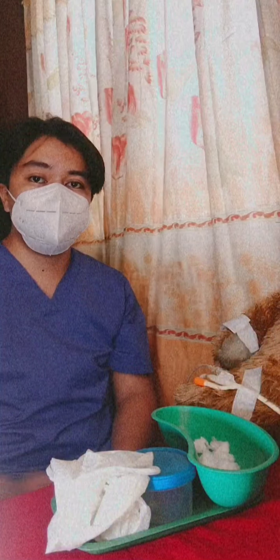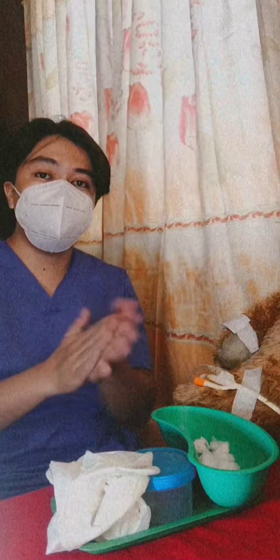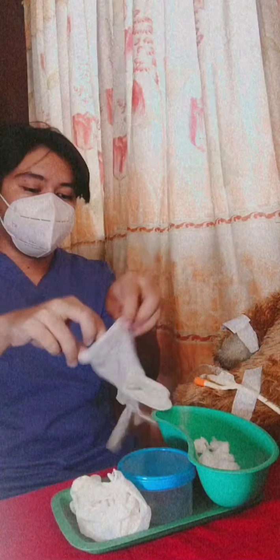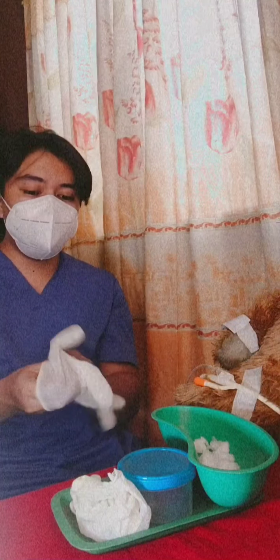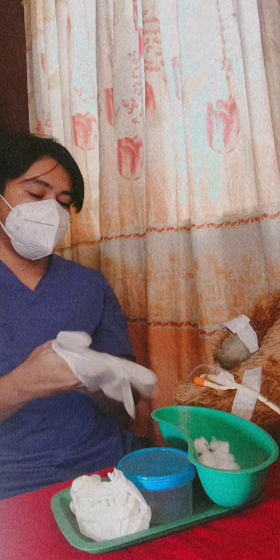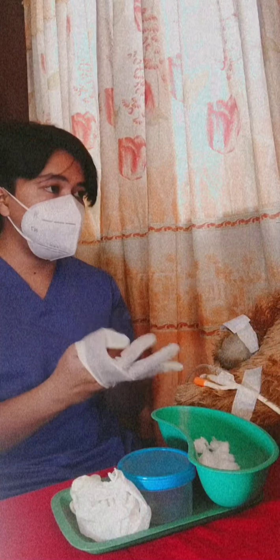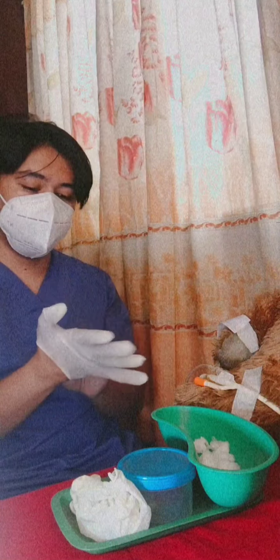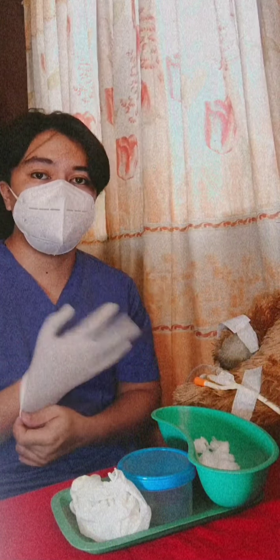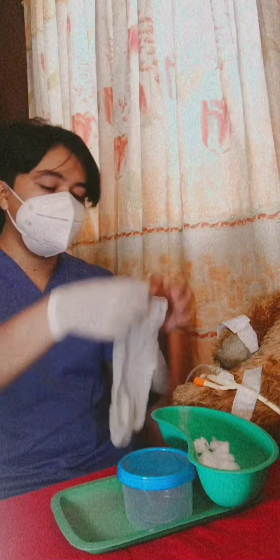Next, we need to perform hand hygiene, and then put on PPE, and then identify the patient. Good afternoon, sir. I'm your nurse for today. My name is John Rose, and you are Mr. Teddy. And then we need to provide privacy by closing the doors and the curtains of the room.